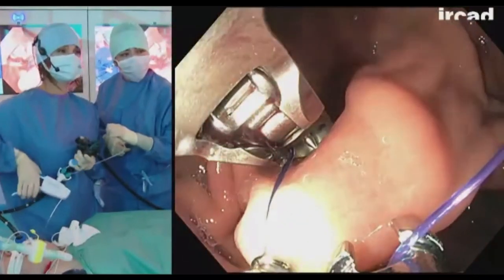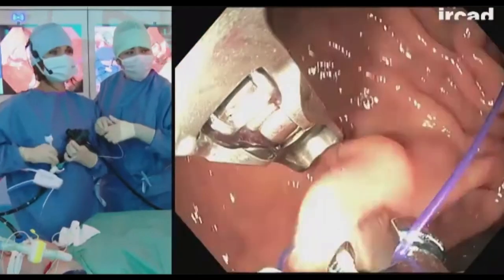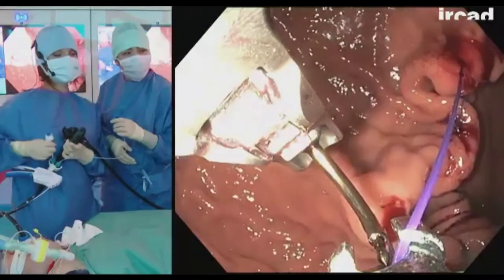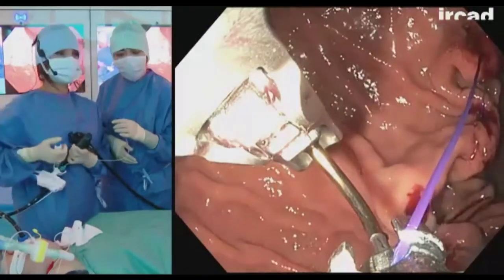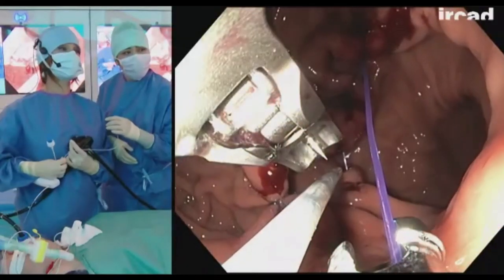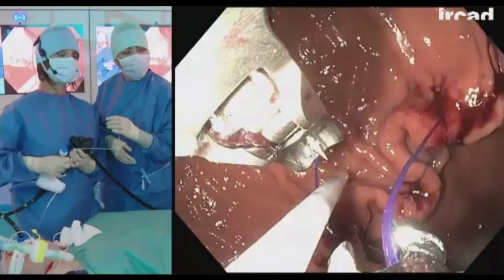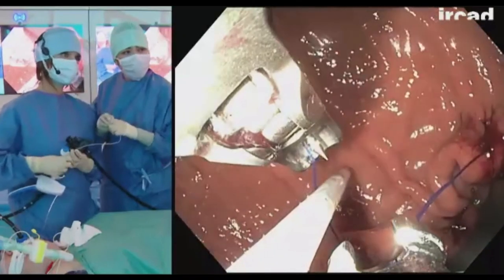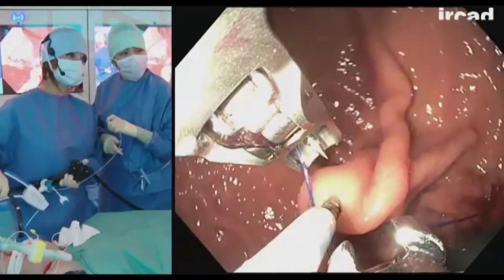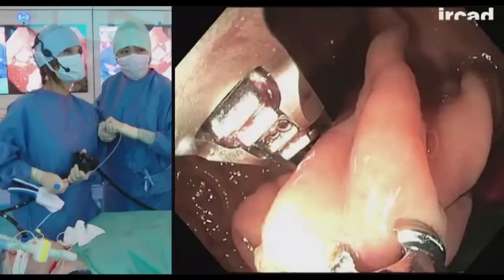I think the key here is really how you grab the tissue, that you go perpendicular, and that you don't place too many stitches, because as you would have the same effect in surgery, if you place too many bites with the same suture, that's not gonna hold properly. So I'm going back to the same point where I started, and this is the posterior wall. So we're gonna go here, and I'm leaving, as you can see here, a little bit of space in between the suture so that I can have that shortening effect that Lee was mentioning before.